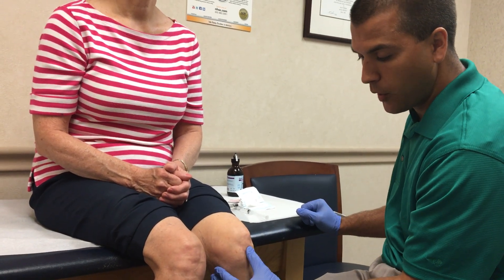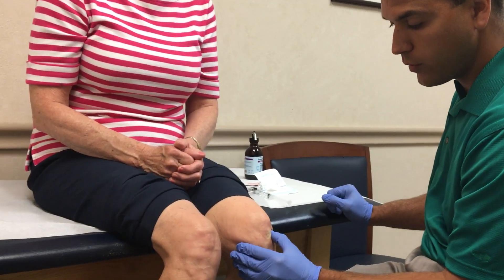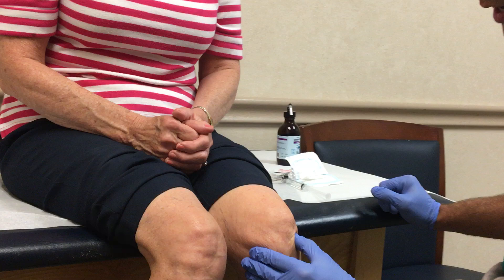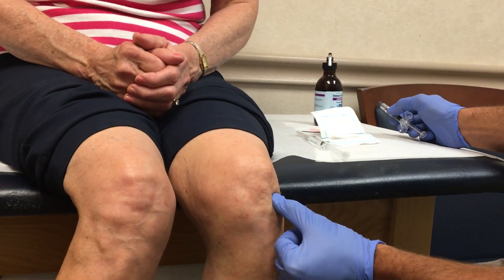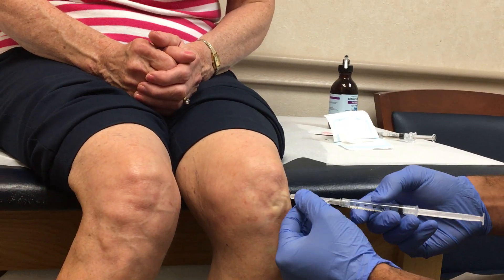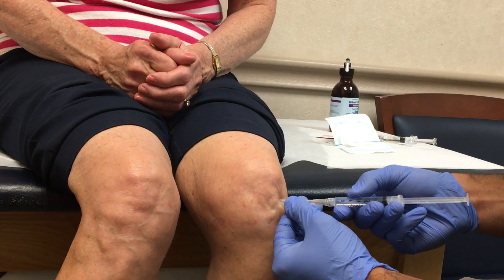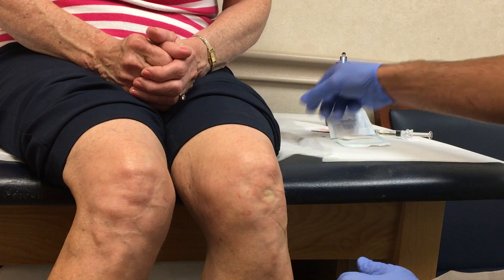Next I'll palpate the inferior pole of the patella, and what I do is I move over the lateral joint line, and I feel the soft spot, and that's where I want to go in, right there. So I'll make a mark with the needle cap where I'm going to inject and give myself a little target for the injection.